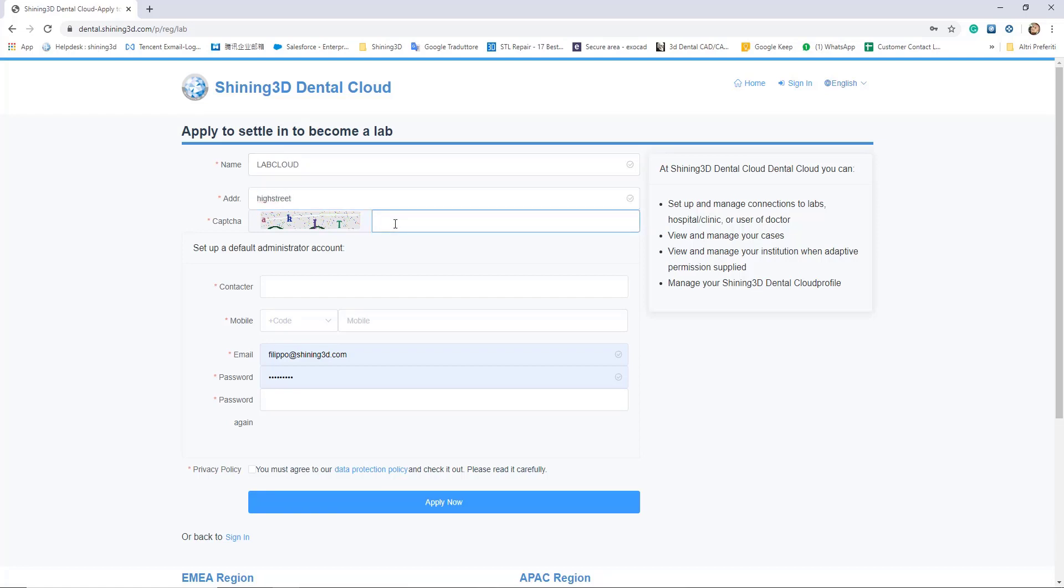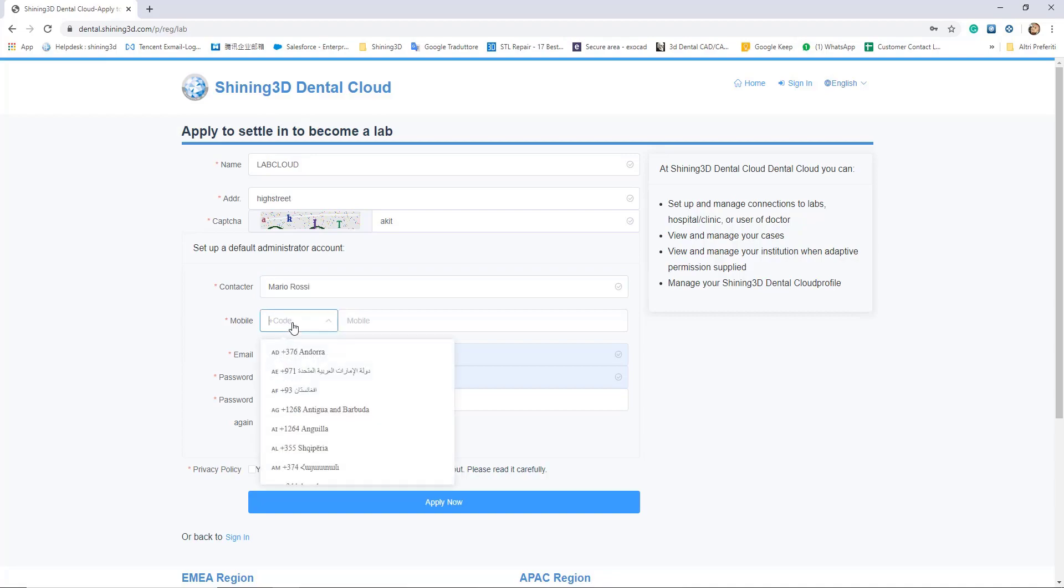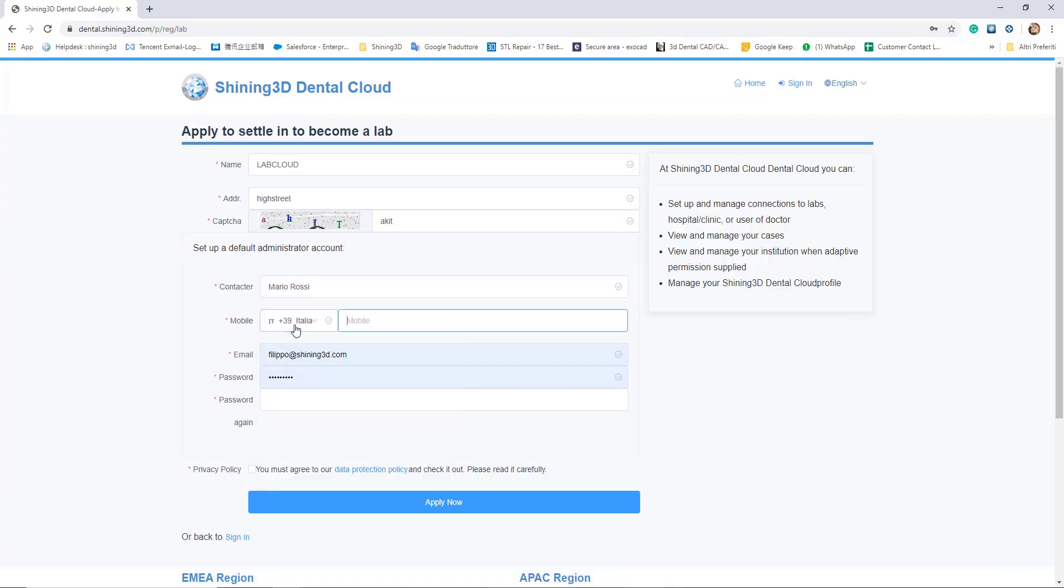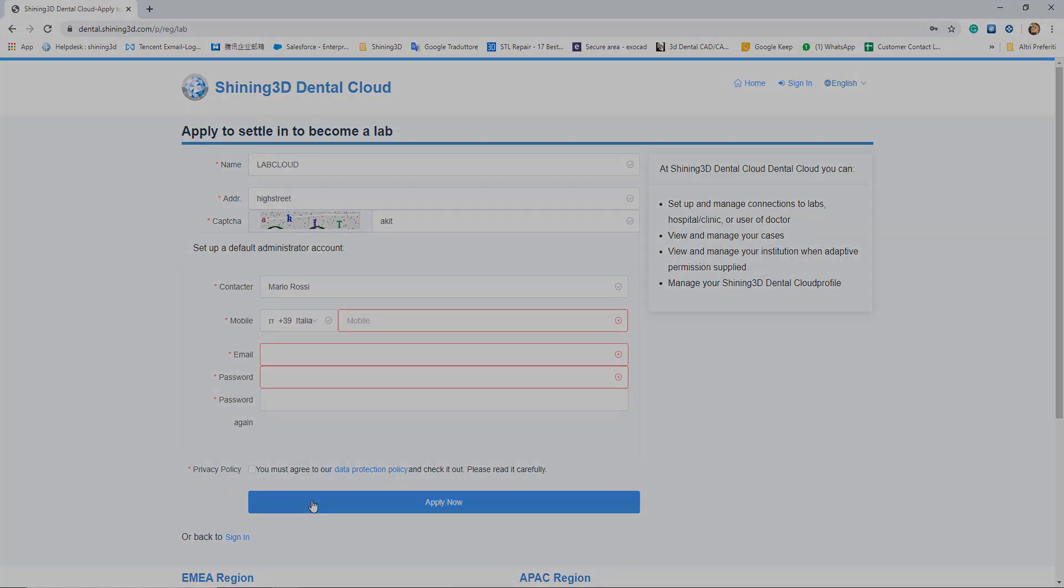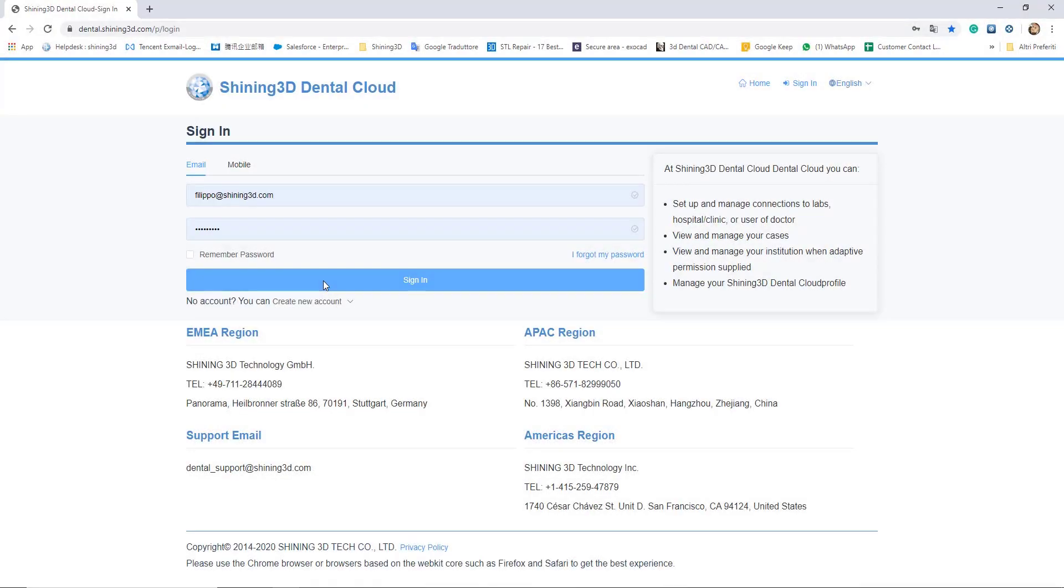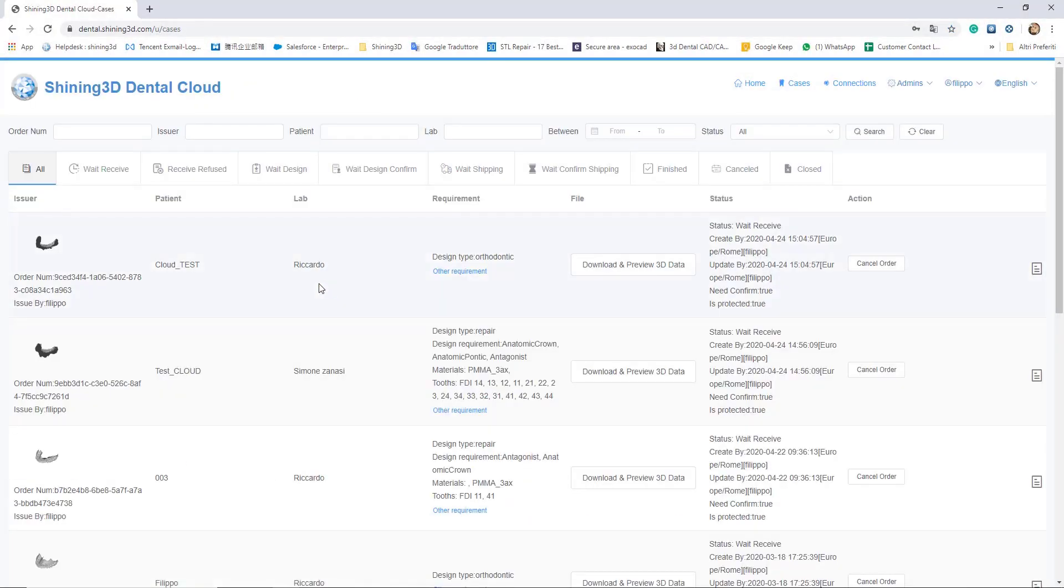It's necessary to fill the forms with your information. If you want to receive an SMS alert when a new file will be loaded on the data cloud, it's necessary also to insert the mobile phone. Once filled all the information and pressing apply, you can enter your data cloud account.